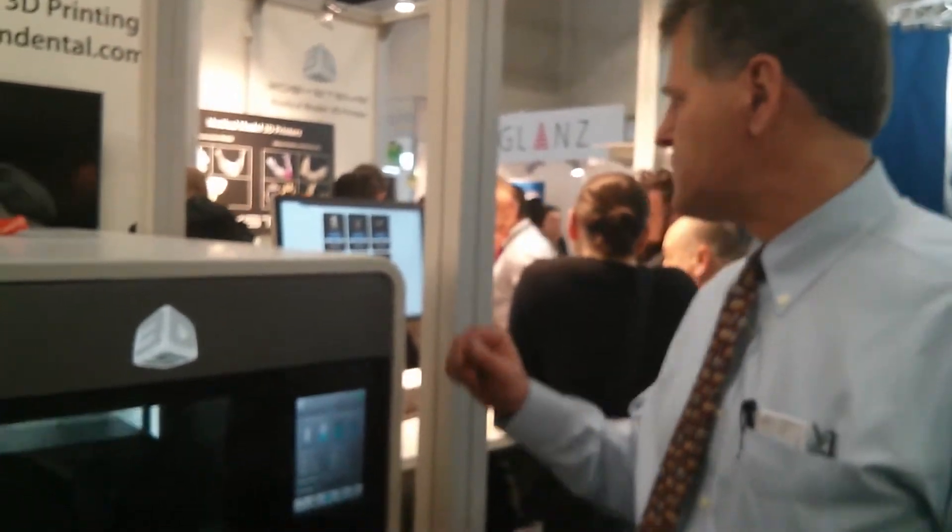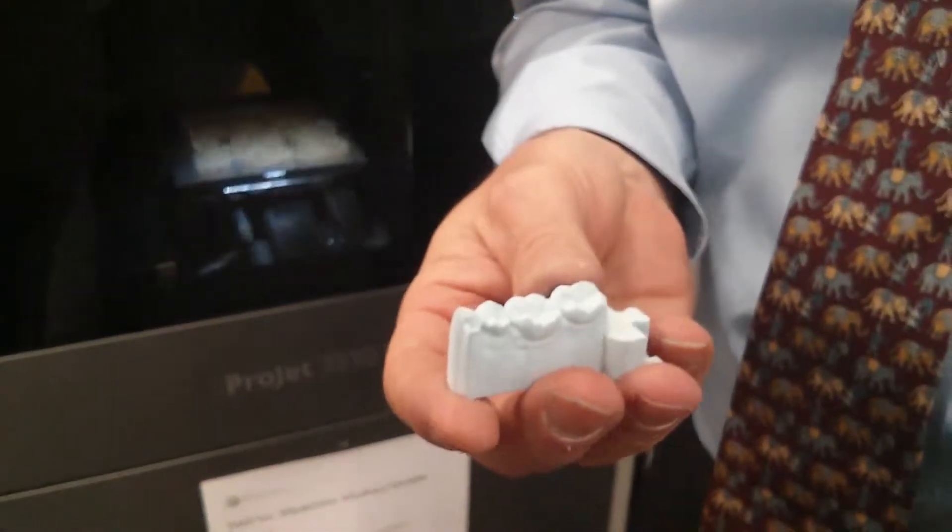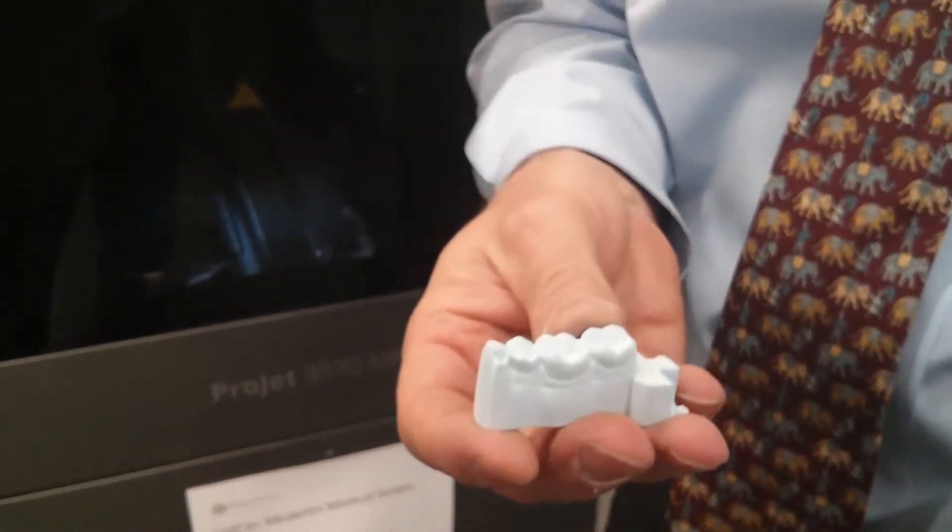Same basic technology inside with the print heads, but a new user interface and a new more reliable feed system. The other thing that's new is the Pearlstone Dental Models. People have been picking these up and thinking that we're a lightweight plaster. It is — it's our new digital plaster.